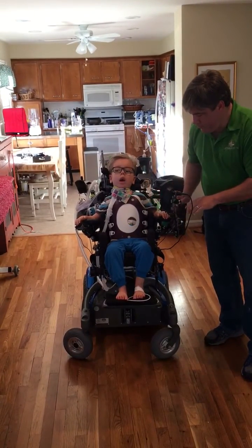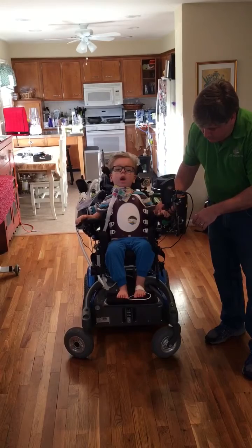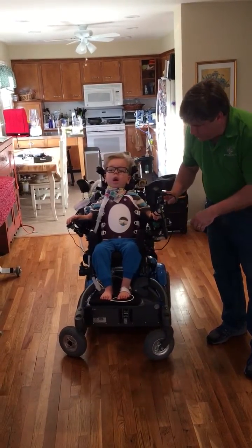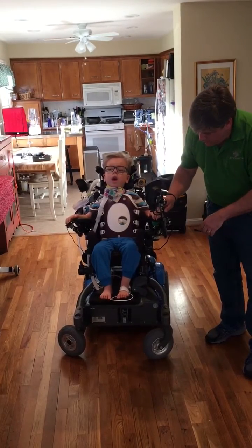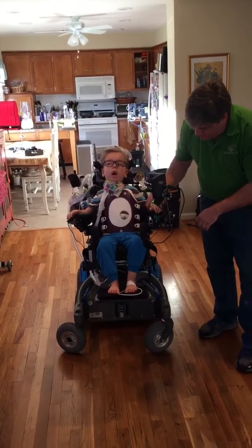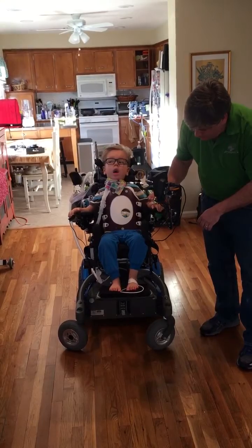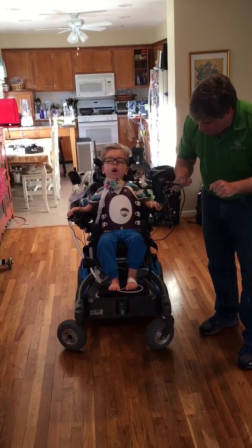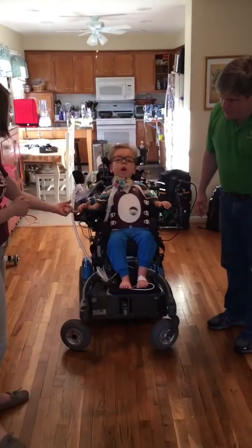Push both hands together and you'll go forward. Get the left hand on. Yep, you're right. That's the problem. Get the left hand on. Both hands, all the way down. There you go. This one over here. All right, now both — two at once. That's perfect. Both together. Squeeze.